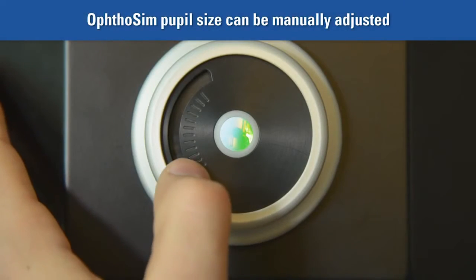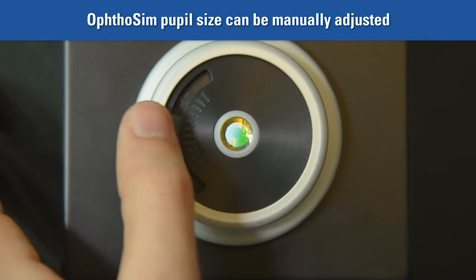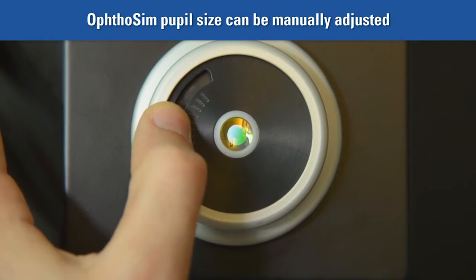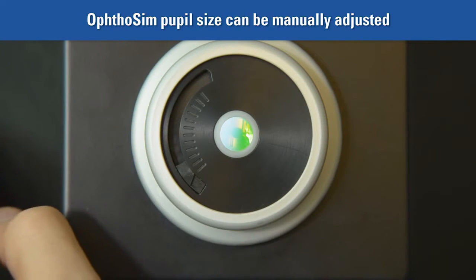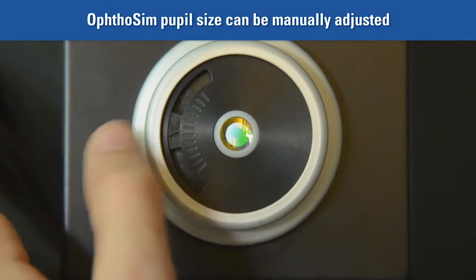For training purposes, you can manually adjust the size of the pupil. Use the dial on the side of the eyepiece to either dilate or constrict the pupil size. A larger pupil size will increase the amount of light entering the unit, thus making it easier to view the retina. For this reason, we recommend using the largest pupil size when first starting out.